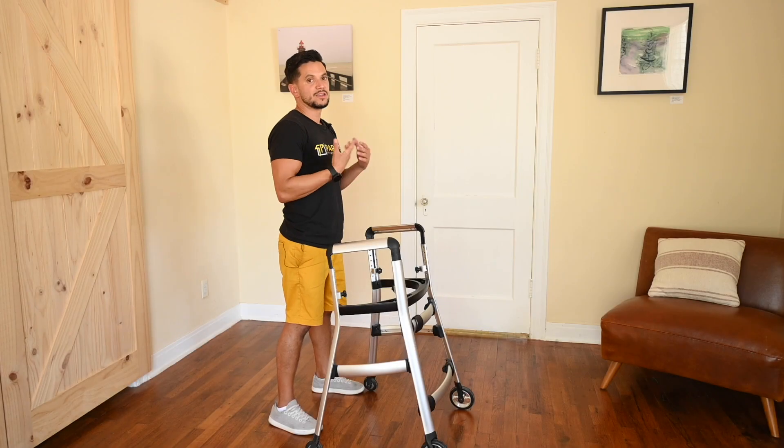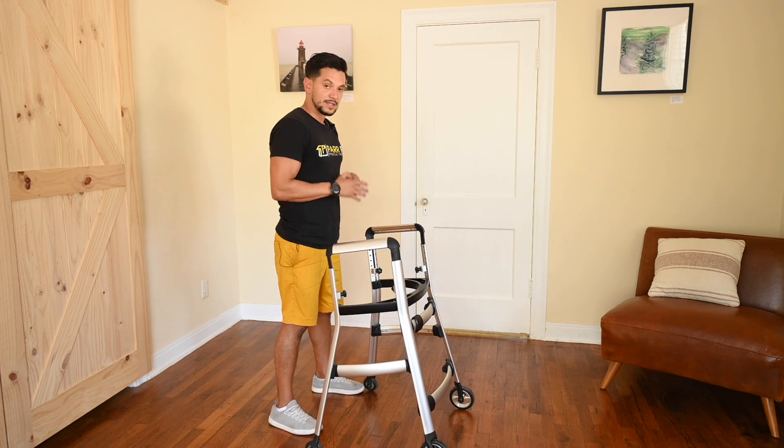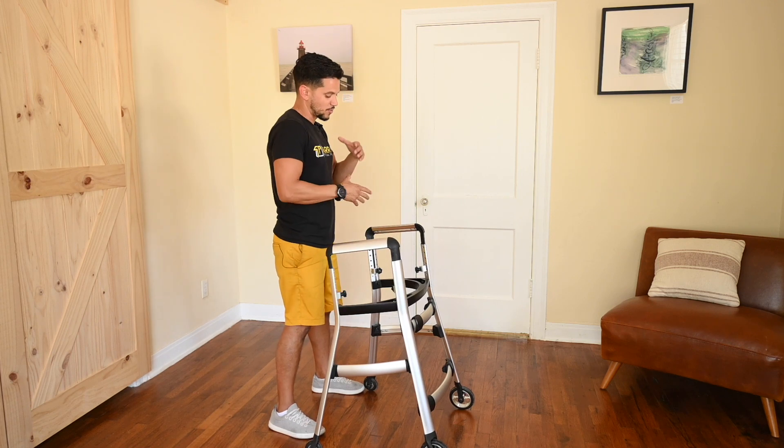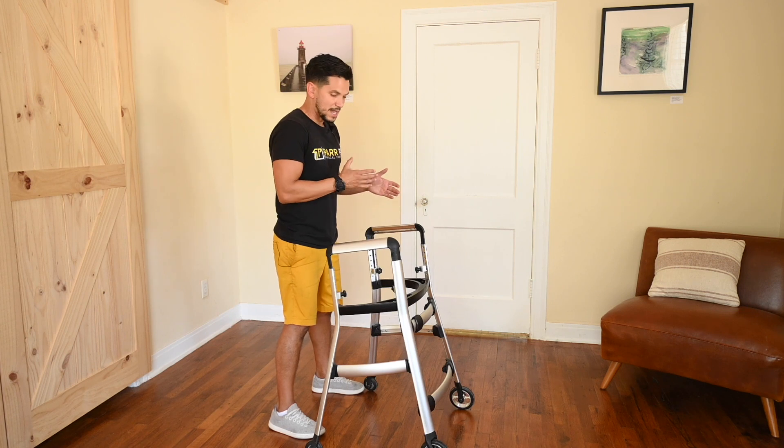The Matrix walker is unlike any other walker that's on the market when it comes to stability and function. Typically what you'll find is that over time and overuse of standard walkers, the bottom tends to get a little bit more rattly and shaky.